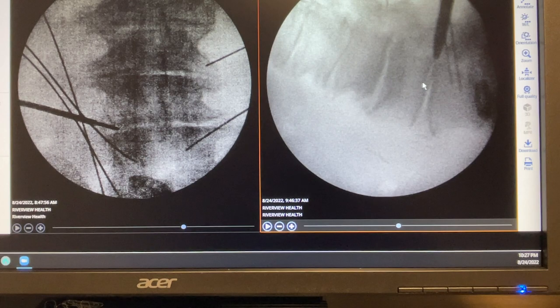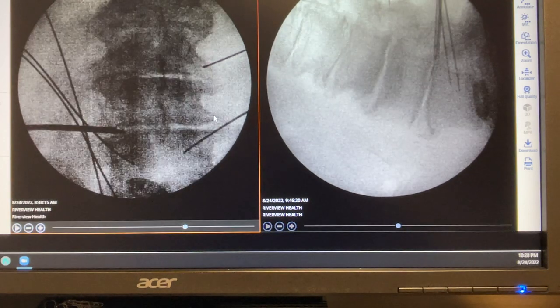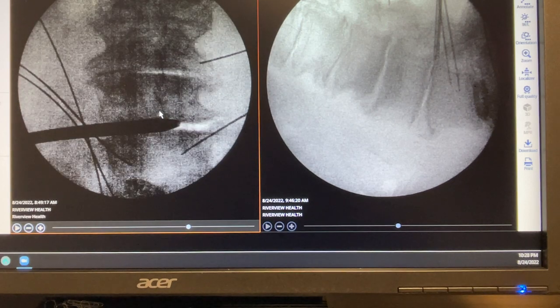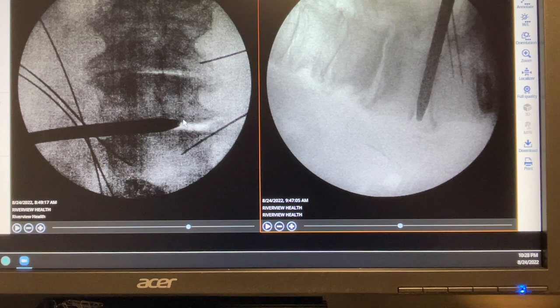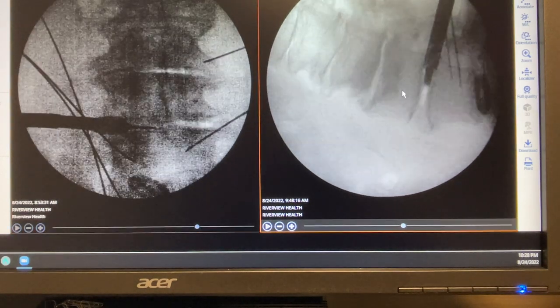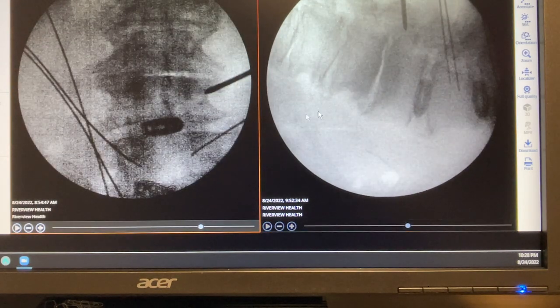Again, we enter the disc using a directionally bent K-wire. We open up the space — this is the so-called anatomic decompression — then put a spacer in and the cage goes in. We then move to the next level. At this point three cages and six K-wires are placed, and we are less than 54 minutes into the surgery.